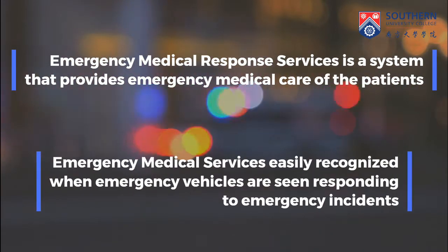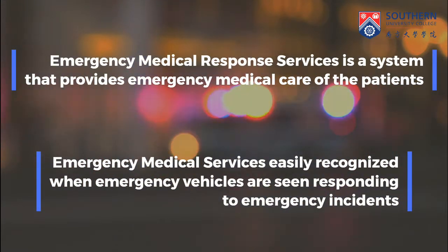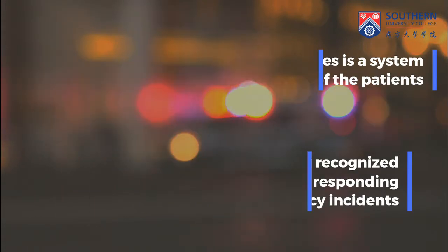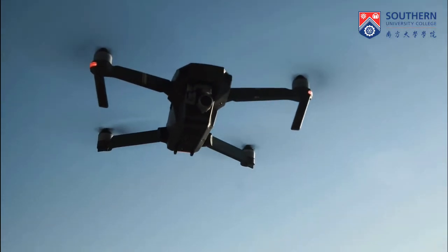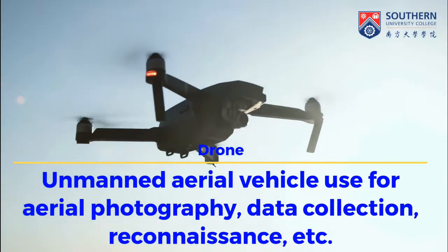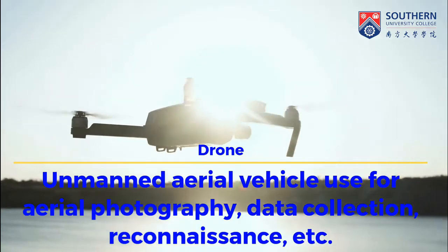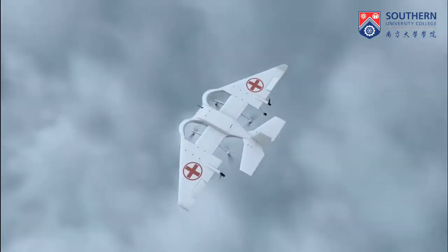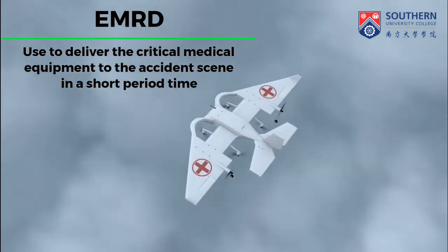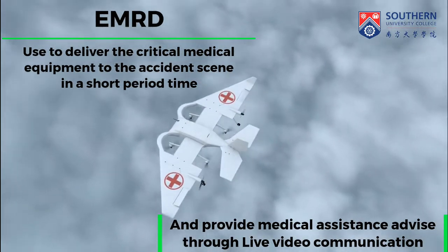EMRD as a system provides emergency medical care of the patients. Drones are normally used for aerial photography, data collection, reconnaissance, and so on. EMRD is designed and integrated with critical medical equipment, and to be dispatched to the accident scene in a short period.